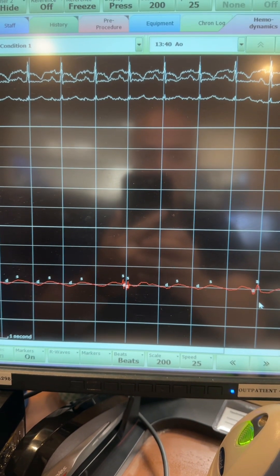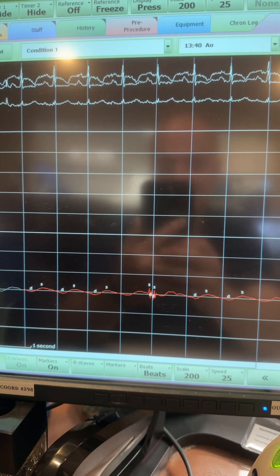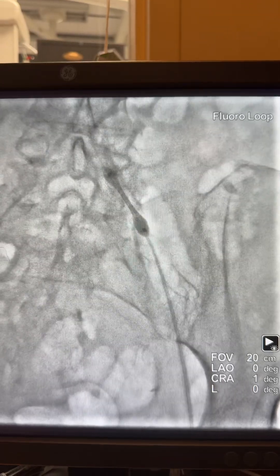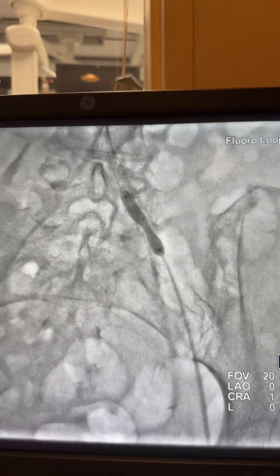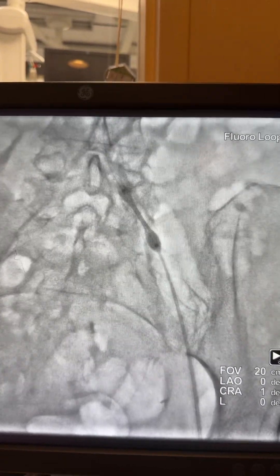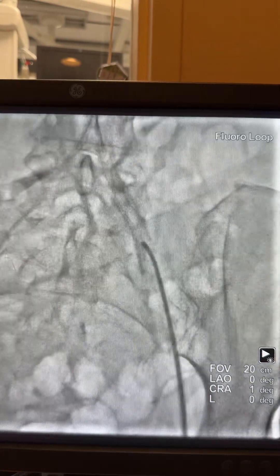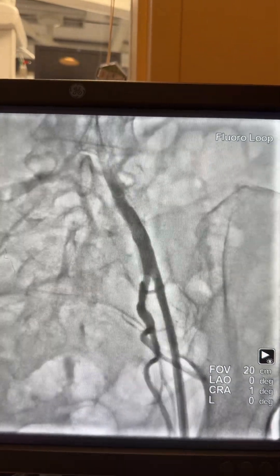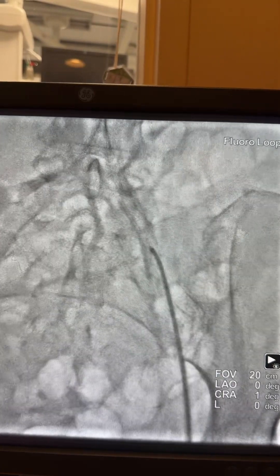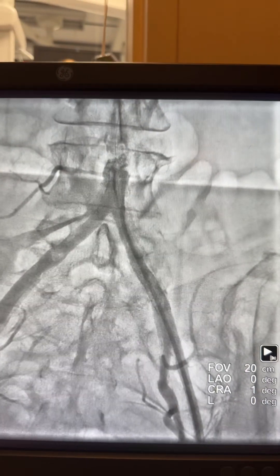However, the pressure waveform is still low — even after opening the iliacs — of course because the aorta is completely occluded. The next step is fixing the iliac artery using a 7.0 millimeter stent — and here is the final result with actually a 6.0 millimeter stent. Here is the final angiogram after giving nitroglycerin.